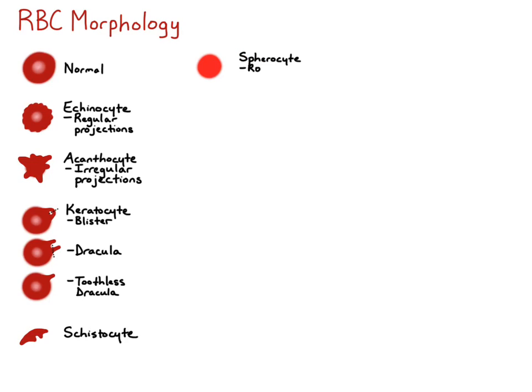The spherocyte is a very round cell with no central pallor. It looks smaller than a normal red blood cell and looks more red. Spherocytes are spherical, like a ball — they've lost their biconcave shape, and this is indicative of immune-mediated hemolytic anemia. You have to be careful when identifying spherocytes because if you look at red cells out at the feathered edge, all of them will take on a spherocyte morphology, so you must be in the monolayer when identifying them.